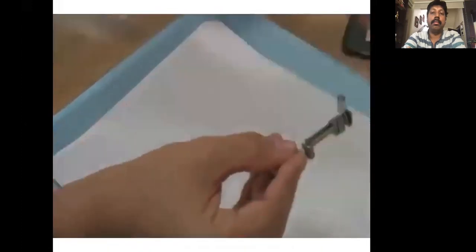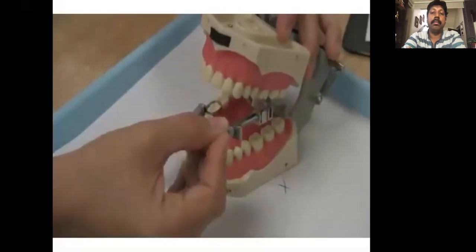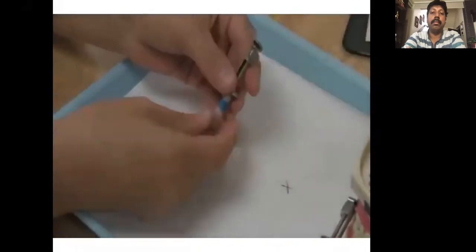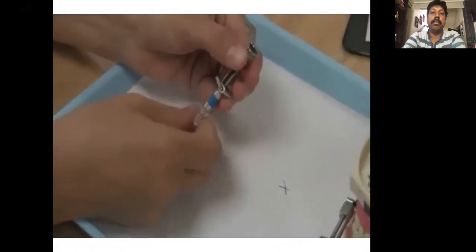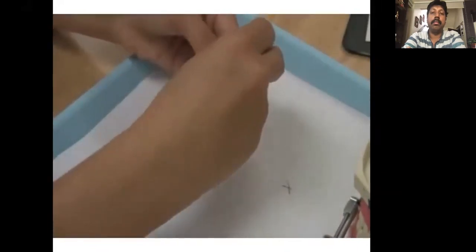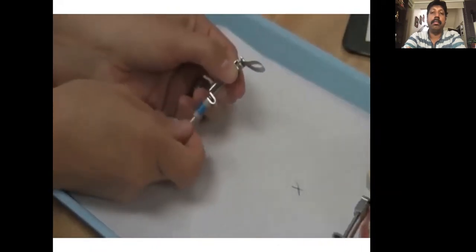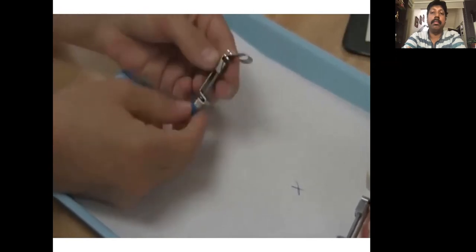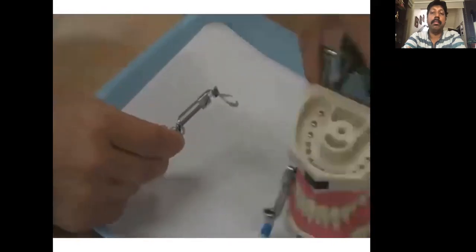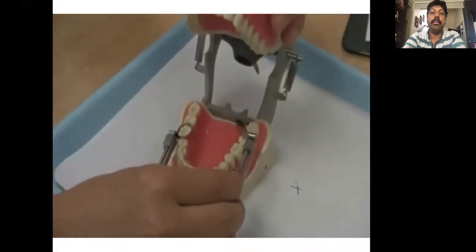It will work on quad 2, and it will work on quad 4. To set up your band for quads 1 or 3, just move the band over to the right side and lock it in place. And now your band will fit quads 1 and quad 3.